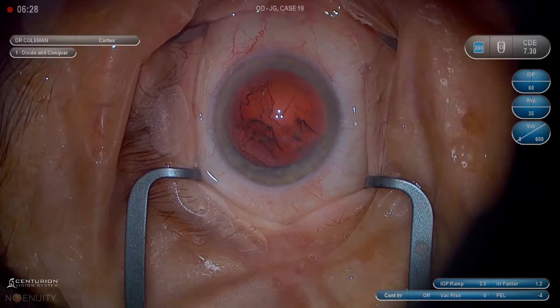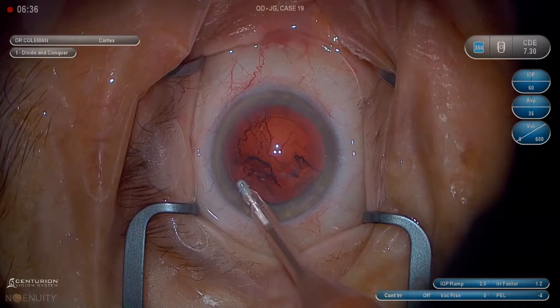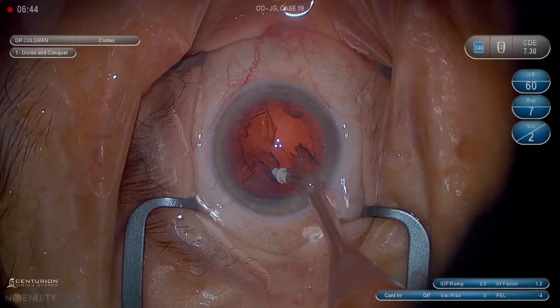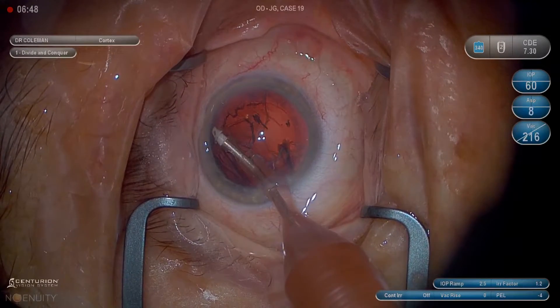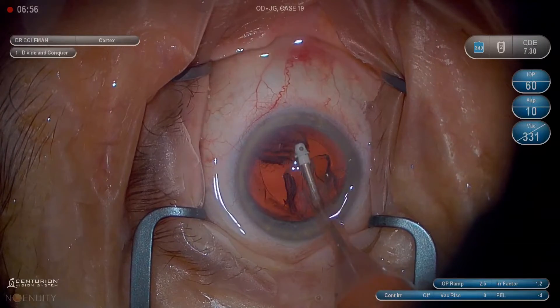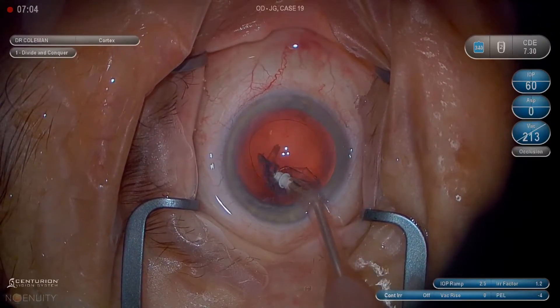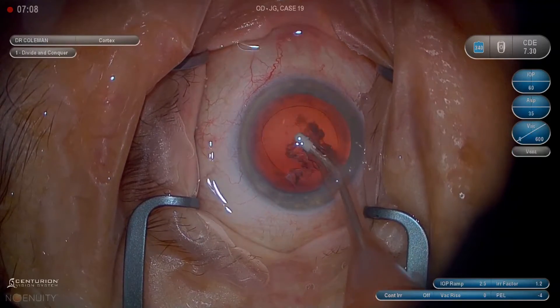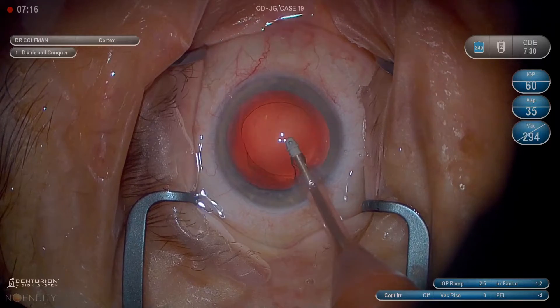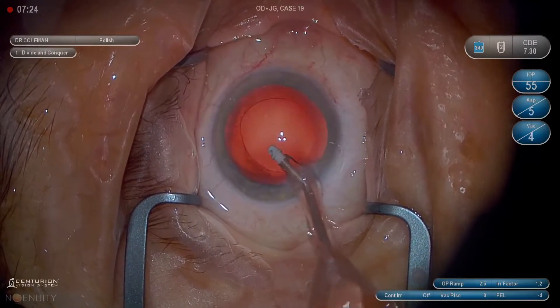For cortical removal, it's important to remember to move in an arc. We don't want to just pull centrally because that puts more stress on individual zonules. If you move in an arc and you have someone with pseudoexfoliation or weak zonules, it's less likely to cause them to tear and vitreous to prolapse around the capsule. Once I've engaged the cortex, I like to push down or posterior slightly to create almost a U-shaped motion — engage it by moving in an arc, add foot as we move down, and peel it away from the anterior capsule before we pull it centrally. That subtle little movement makes it a lot easier to get cortex efficiently. We can polish a little if we need to — polishing is really about contact and rubbing the surface of the posterior capsule more than irrigation aspiration. We want to be very gentle on the foot there.